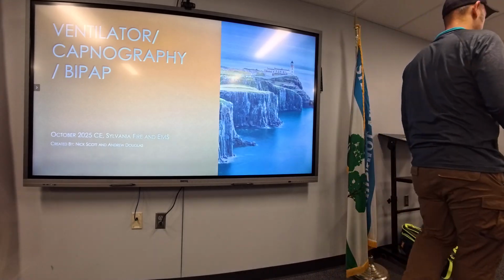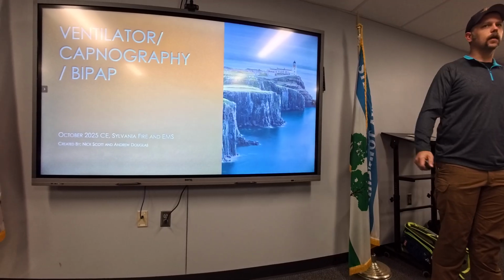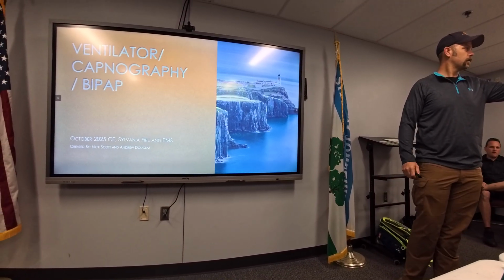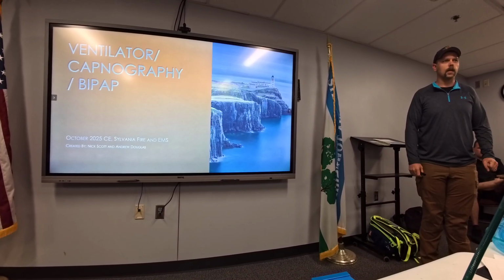All right, guys. So, ventilator, capnography, BiPAP. This is Kelly back here. She's an RT from Toledo, correct? Yes. Okay. So she's going to be helping us out. This is going to be a lot of hands-on this month.